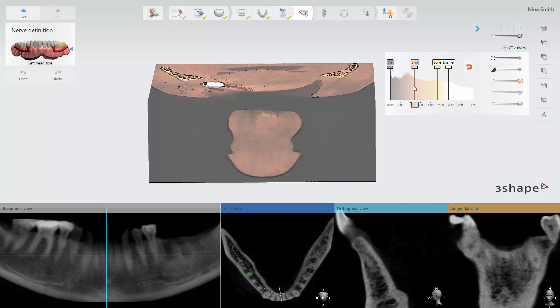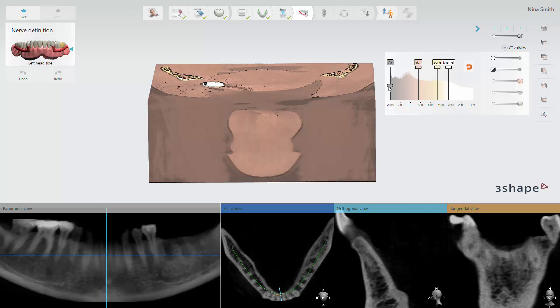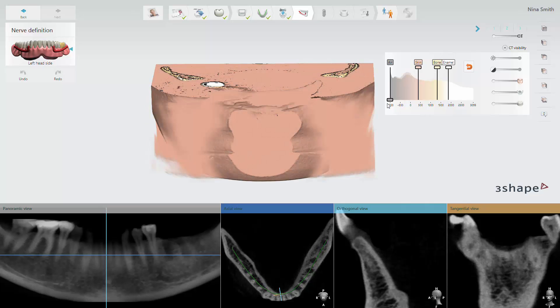If we move a slider from left to right, we change the visualized density of the selected layer. If we move a slider up and down, we turn on and off the visibility of the selected layer or material.